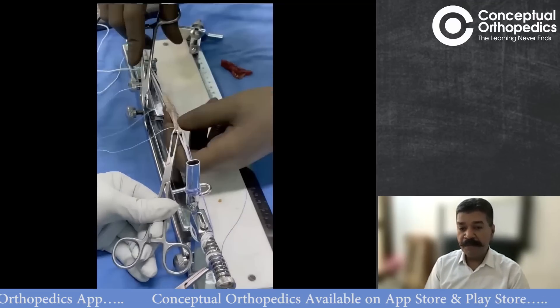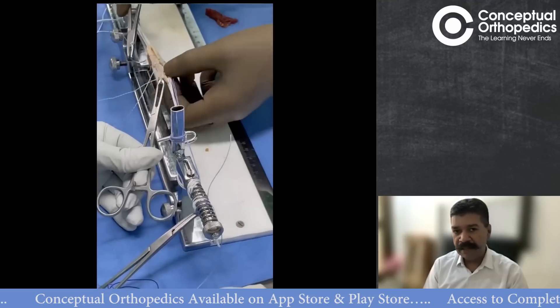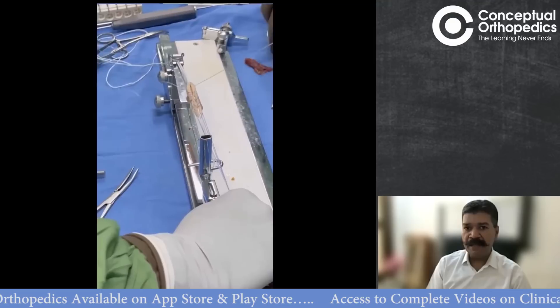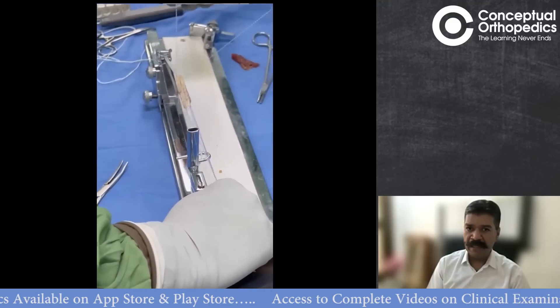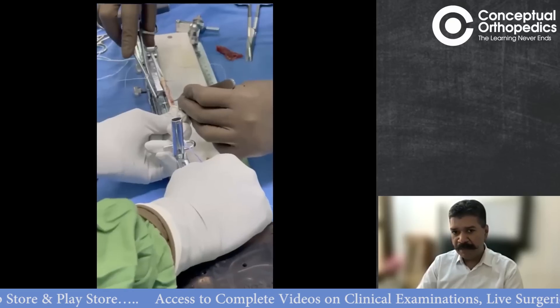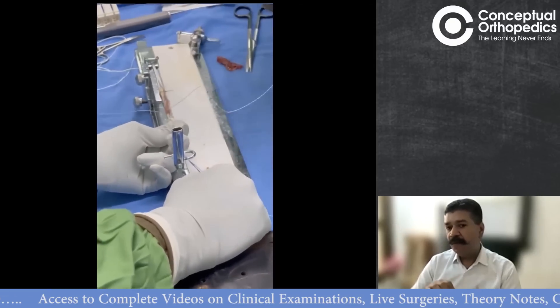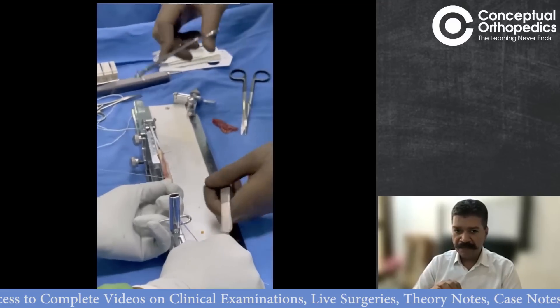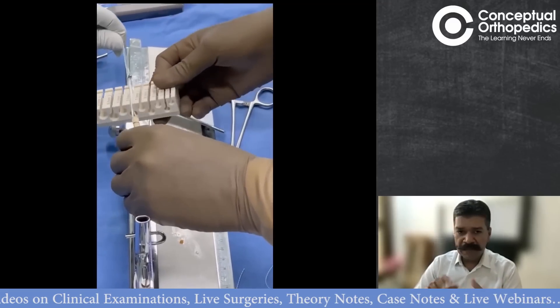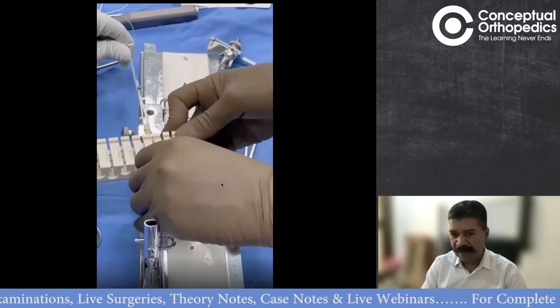In this particular instance, a simple four-folded semitendinosus was only coming to seven millimeters in diameter. But with the all-inside type preparation, I was able to increase the diameter to seven and a half millimeters. Don't be fixated by eight millimeters as the bare minimum needed for all hamstring grafts — it depends more on the size of the knee and the femoral condyle. For a very short patient, even a seven or 7.5 mm graft may be appropriate.